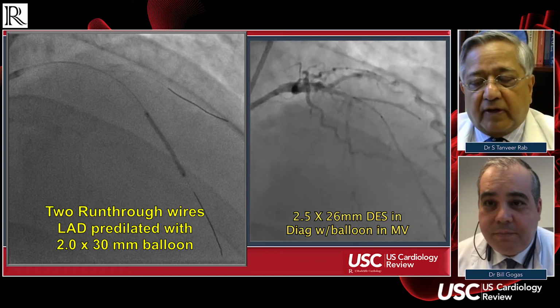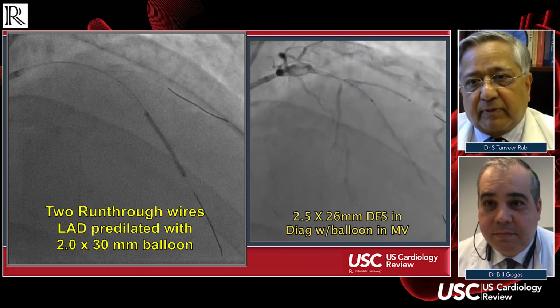use of contrast, though. For proximal lesions, people have been using saline flushes, and they have been having quite good results. I've seen our colleagues in Canada do that. They just use saline flush for really proximal lesions, and not worry about contrast, and they get a pretty good idea. So this is the positioning of the diagonal side branch stent.